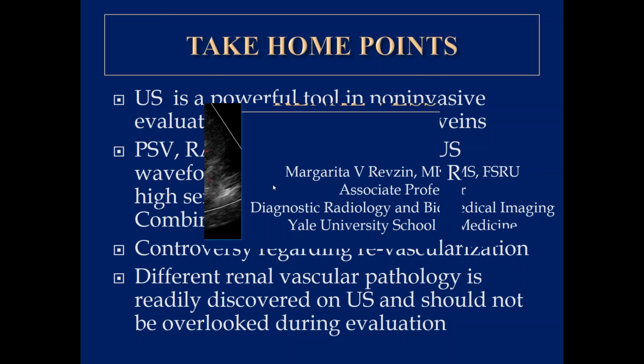So I just come from the side and behind the patient, but keep the patient in supine position. That will minimize the distance from the transducer to the kidney and help me to visualize the vessels better.